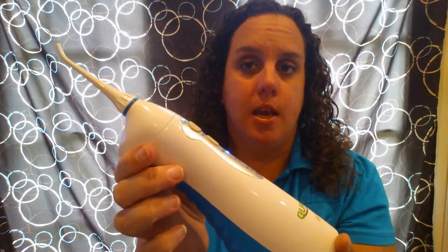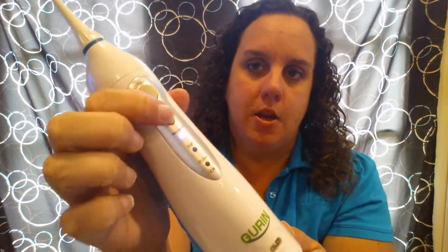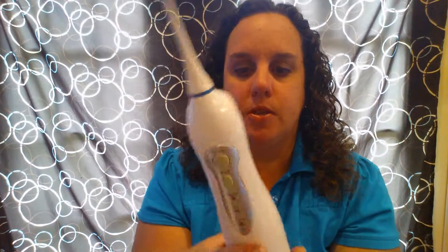It comes at least partially charged — straight out of the box, I haven't charged it, and as you can see it's already working. You can cycle through three different modes; that's the pulse mode, you can hear the different noise. I don't want to run it too much since there isn't any water in there — I'm not sure if I could damage something.